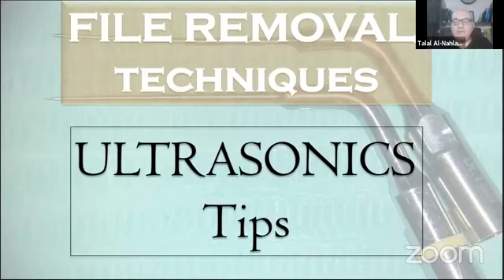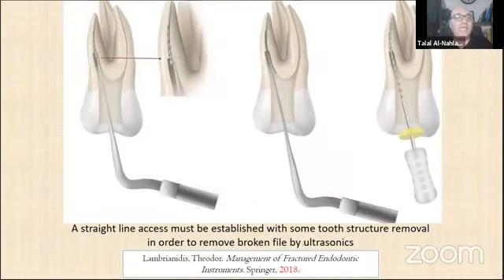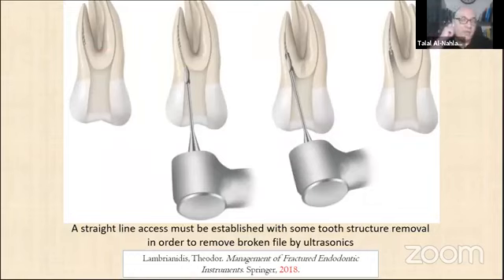We don't have time to speak about all the techniques, but I will mention the ultrasonic technique. I mentioned many techniques when I did a presentation one week before with Zoomax. But here I will mention only the ultrasonic. When we want to remove a broken file, we have to create a straight line access with a GG file, size 2 or 3.